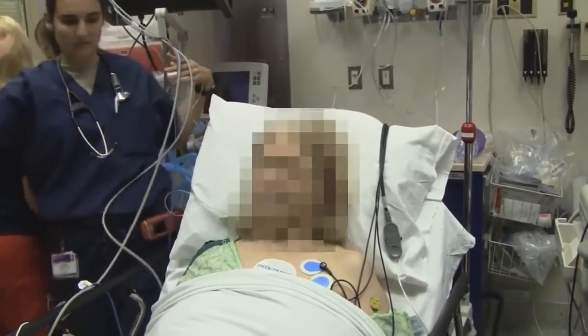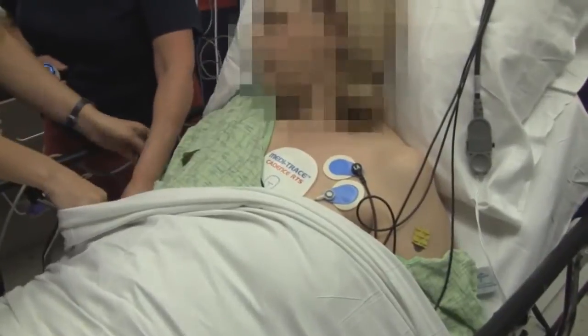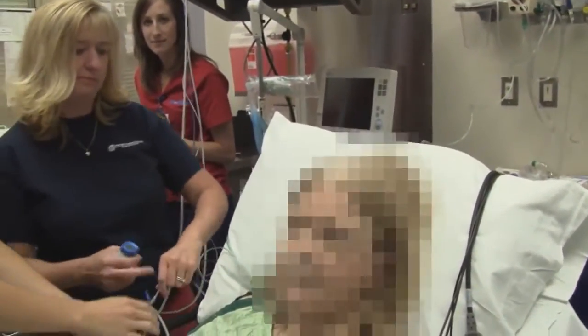So in a minute we'll be doing that. We're going to do propofol. Are we all set for the procedural sedation? We are. And you understand this will be on YouTube, but your face will be blurred — that's right.